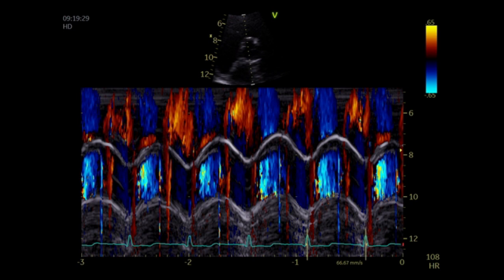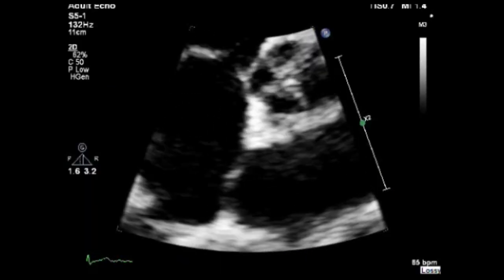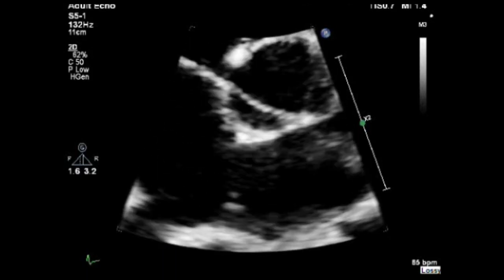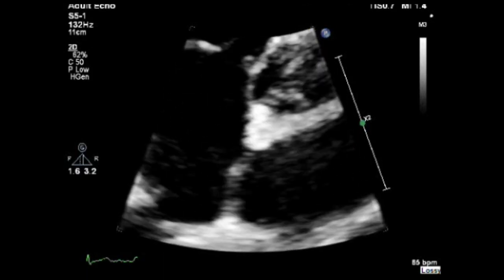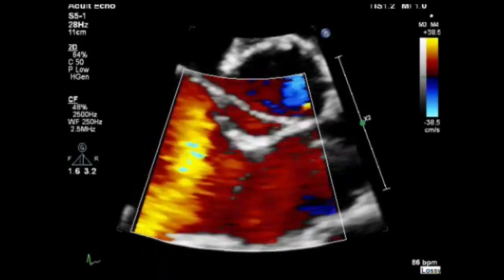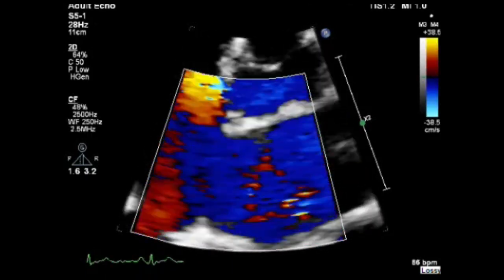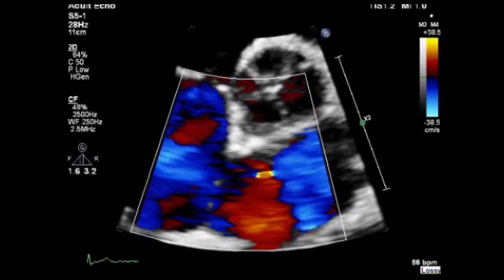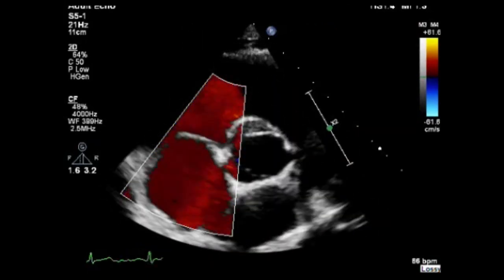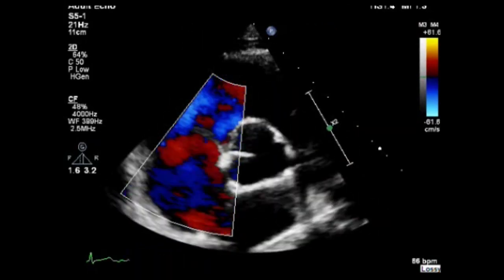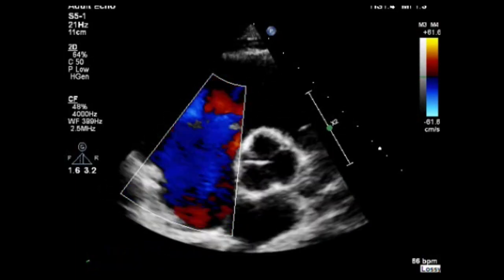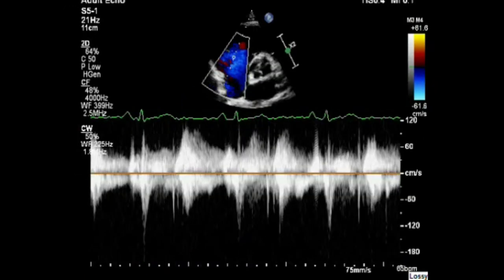Now do a visual assessment of the interatrial septum — a zoomed image is always recommended to assess the interatrial septum integrity. Use color Doppler to assess for transseptal flow and reduce the scale to identify any PFO flow. Now place the color flow Doppler over the tricuspid valve and visually assess for any tricuspid regurgitation. Use continuous wave Doppler to obtain any tricuspid regurgitation flow and measure the tricuspid regurgitation peak velocity if needed.